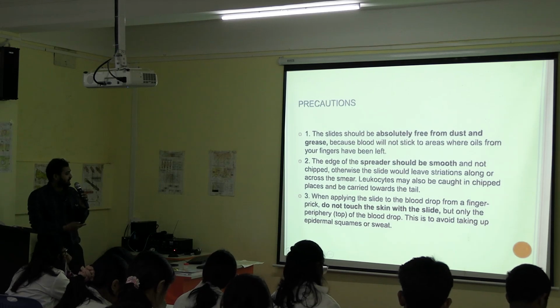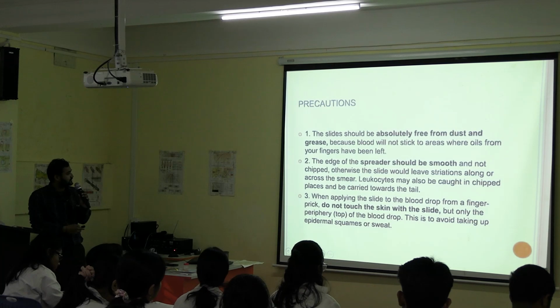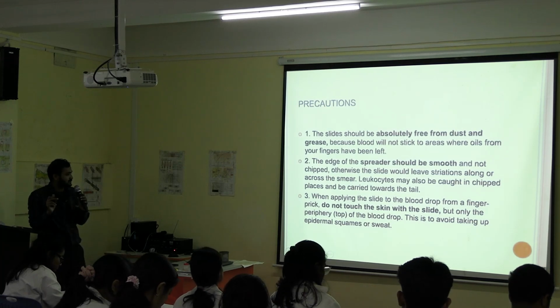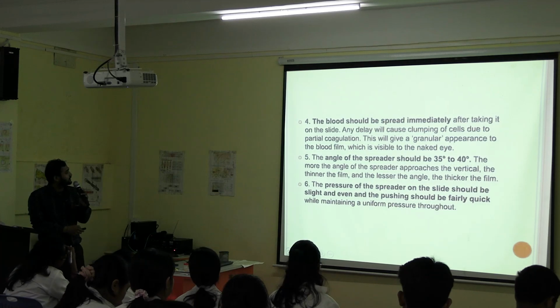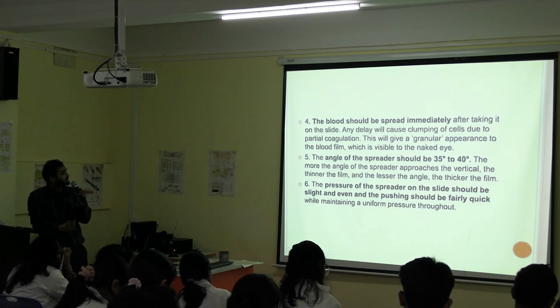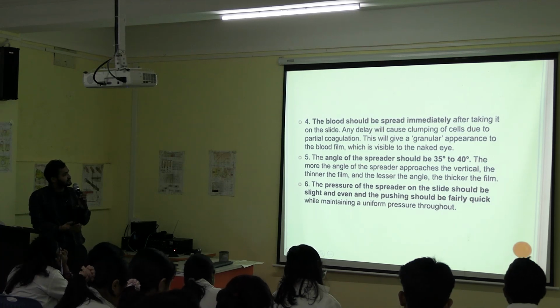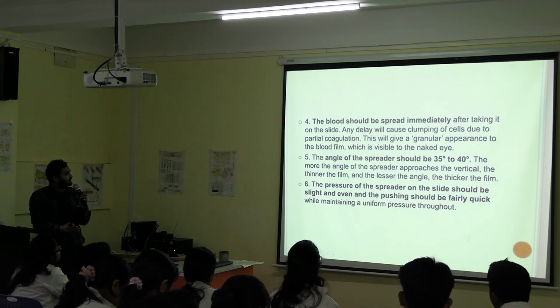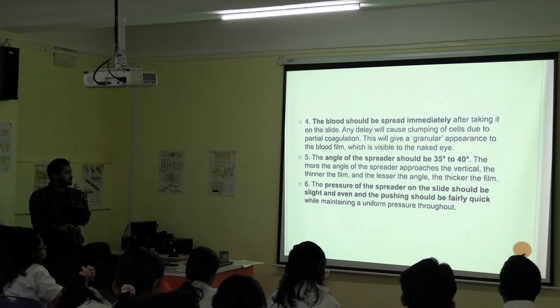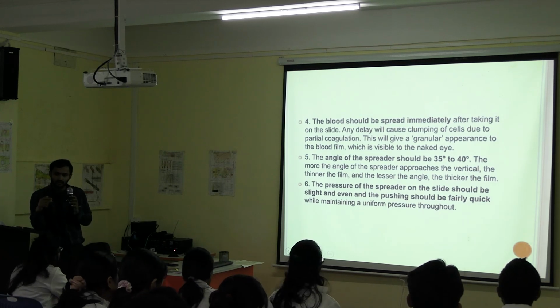This is to avoid taking up epidermal squames or sweat. That is why we don't touch the finger, only the drop should be touched. The other precaution is that the blood should be spread immediately after taking it on the slide. Any delay will cause clumping of the cells due to partial coagulation. This will give a granular appearance to the blood film, which is visible to the naked eye. So within 30 seconds you need to make the smear.